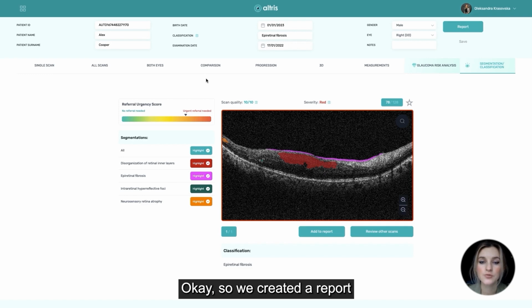Okay, so we created report, and now you know how to create it on your own. Hope this was helpful, and see you in our next tutorial.